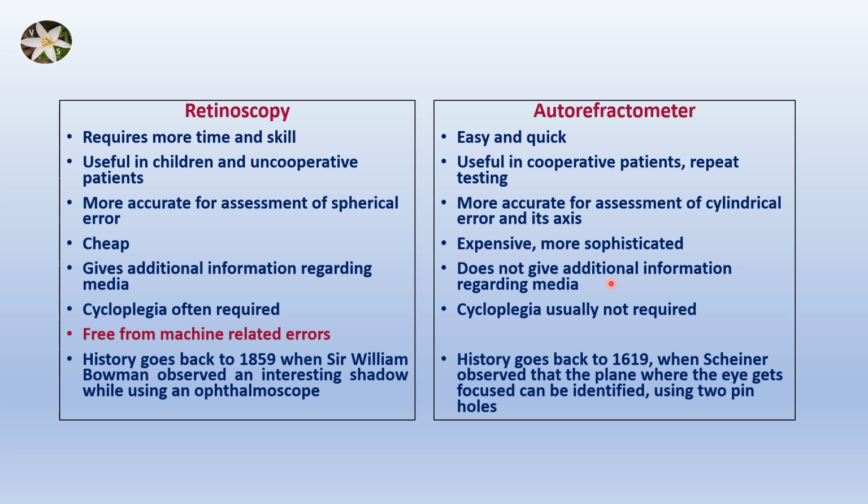The history of retinoscopy goes back to 1859 when Sir William Bowman observed an interesting shadow while using an ophthalmoscope. And that of autorefractometer goes back to 1619 when Scheiner observed that the plane where the eye gets focused can be identified using two pinholes.